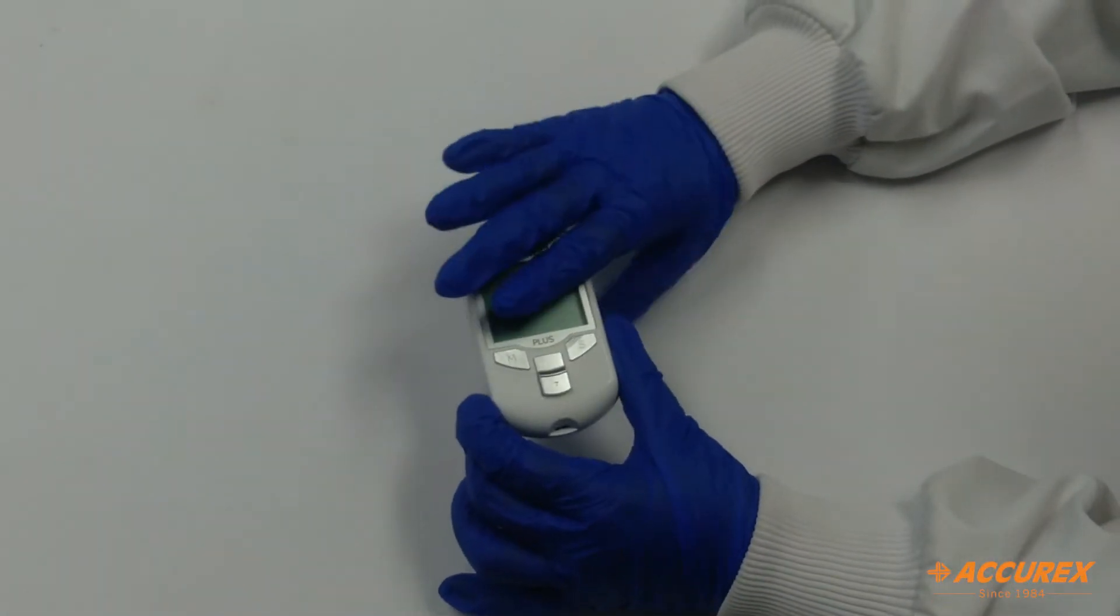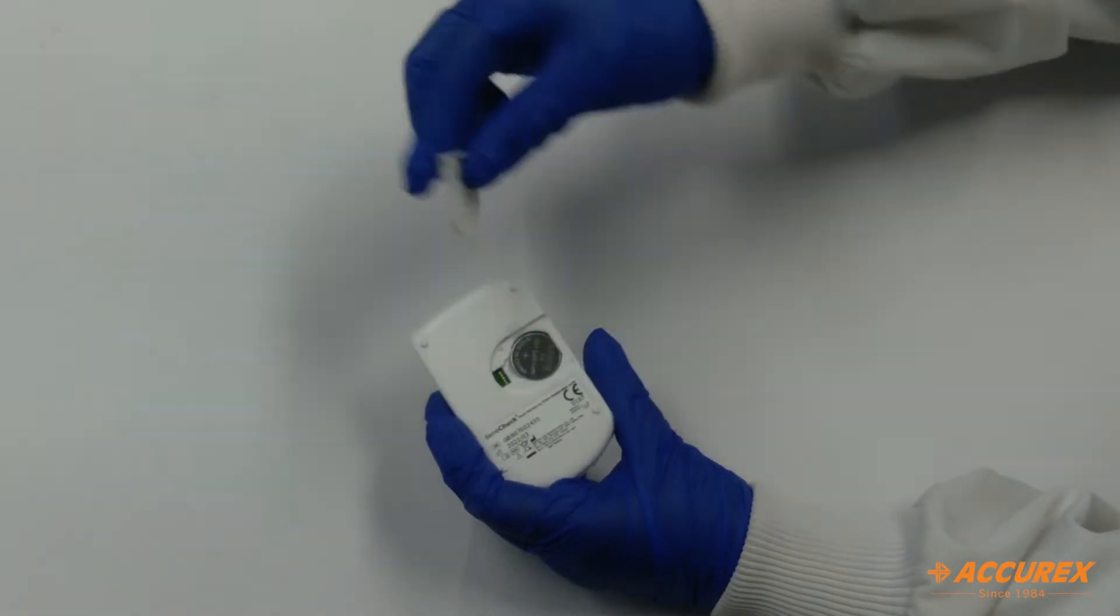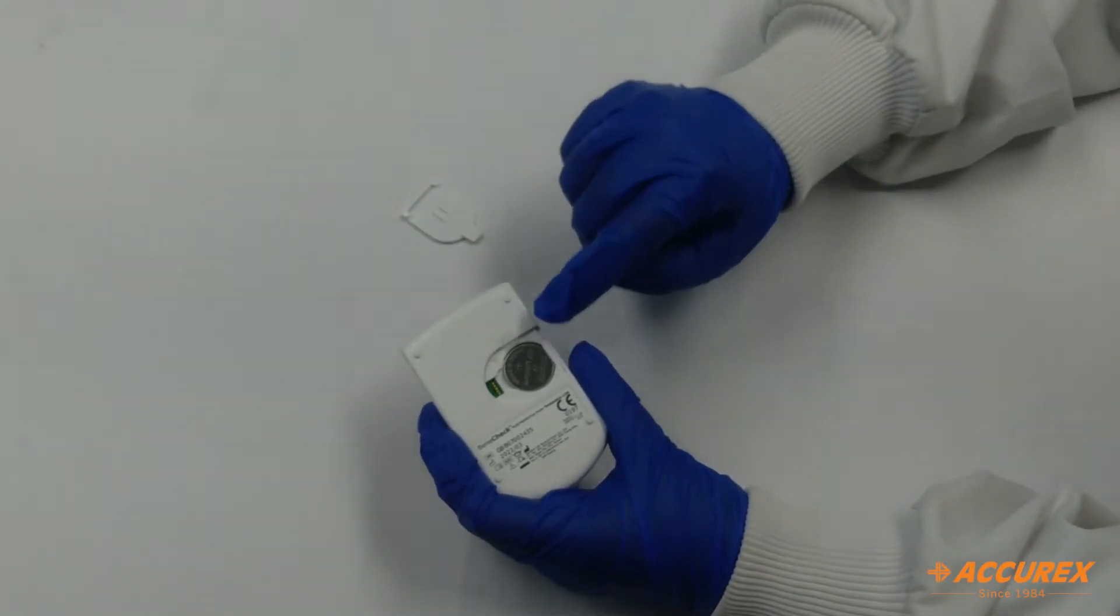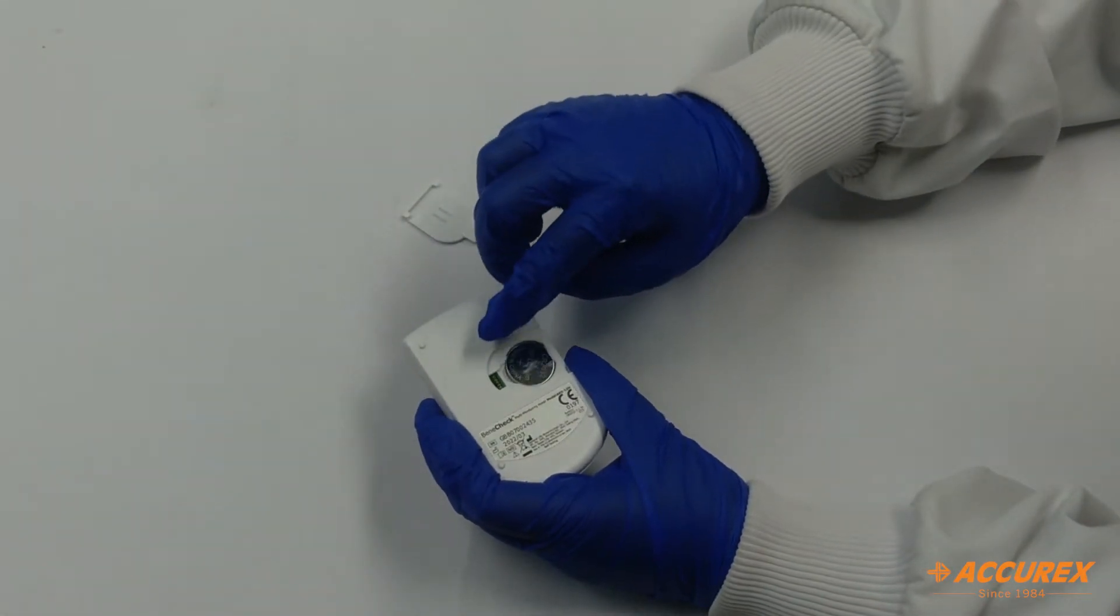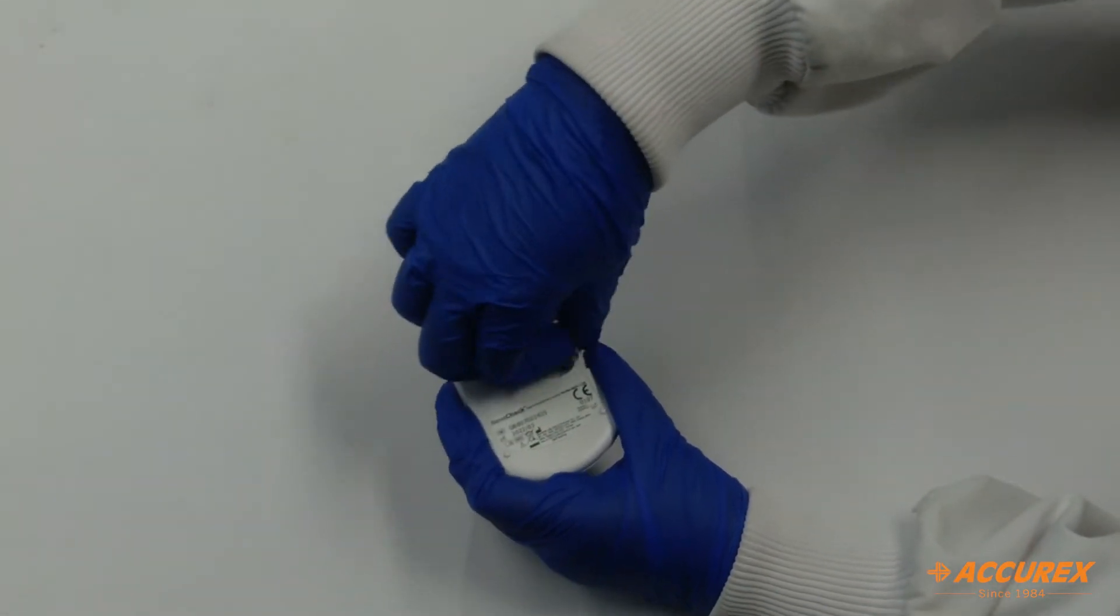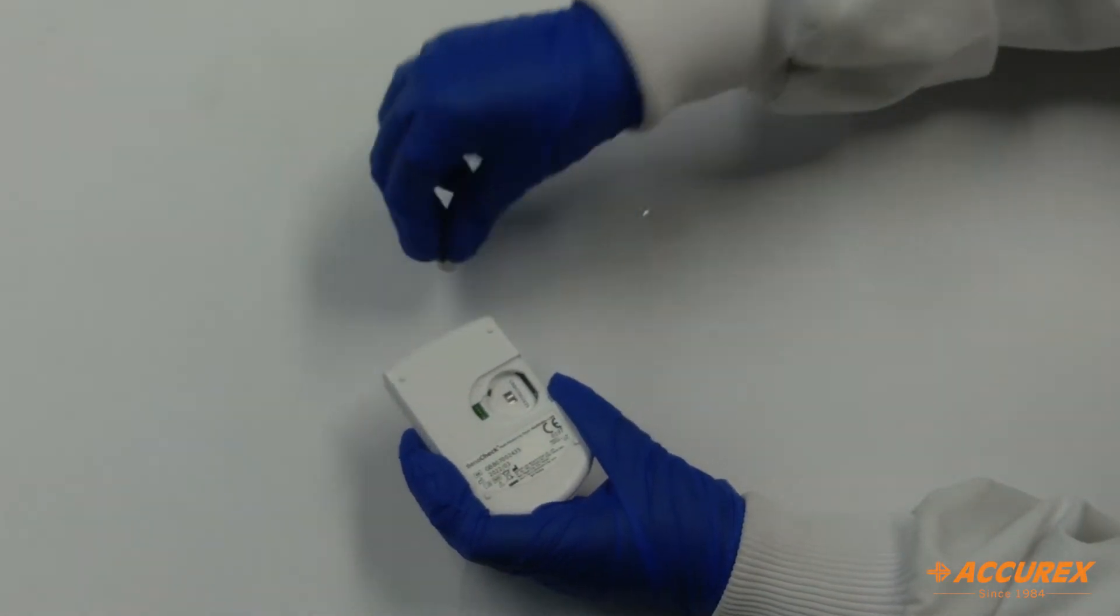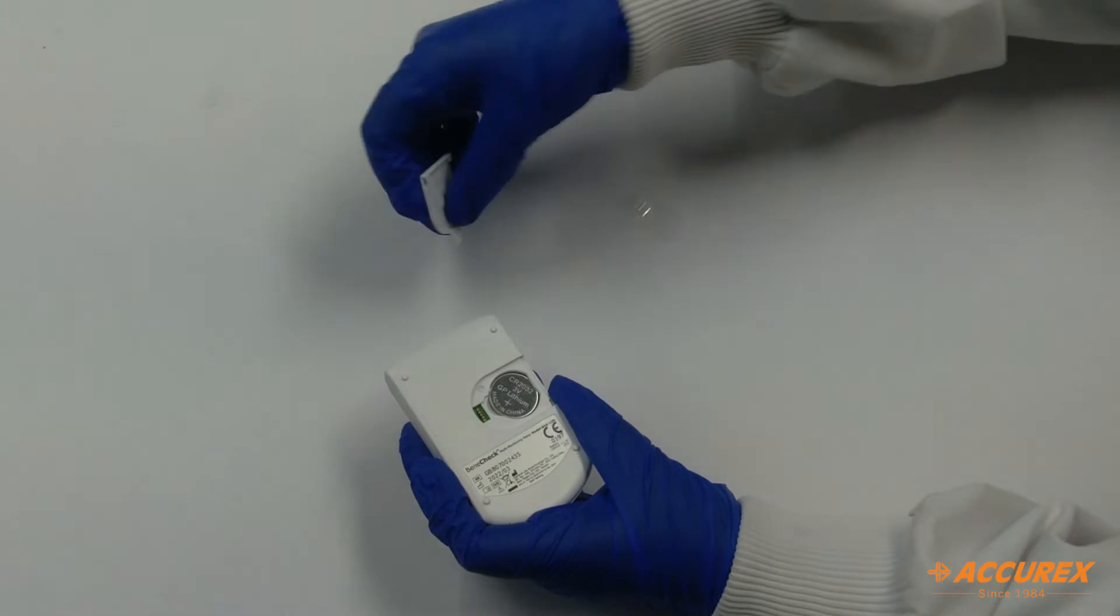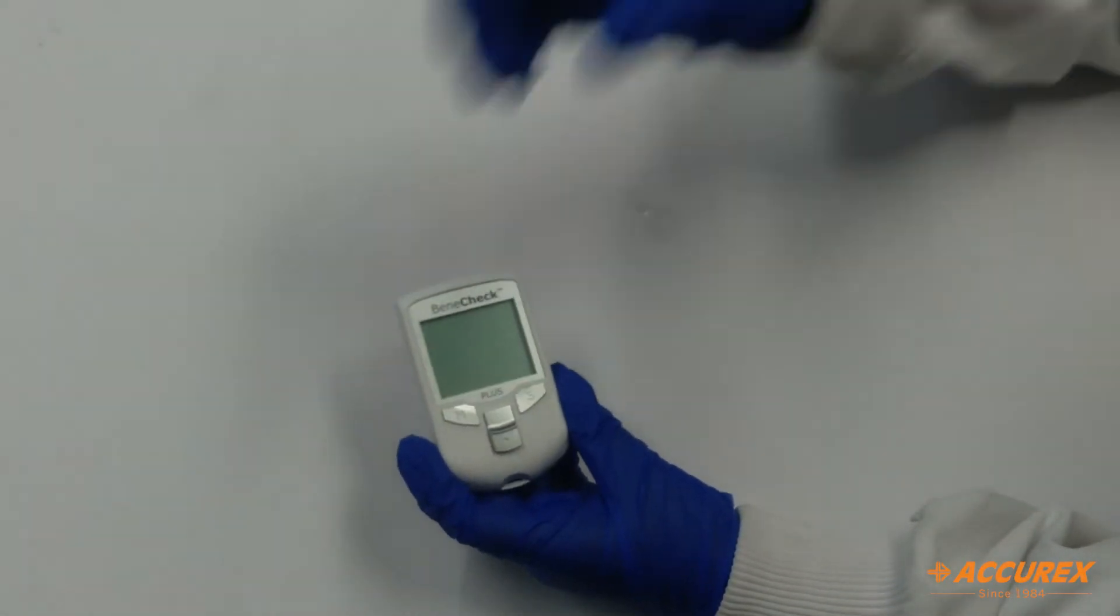Now we will see how to turn on this meter. From the back side you just need to pull this and there is a battery given over here but below the battery there is a plastic sheet. You need to remove this plastic sheet. Remove the lithium battery, remove this plastic sheet and then insert this lithium battery and close the lid. The meter will be switched on.